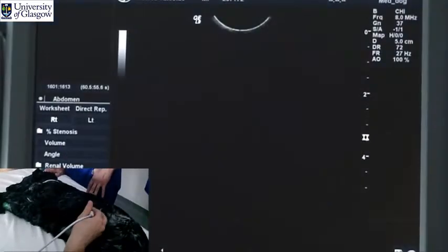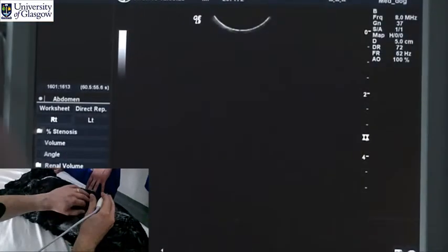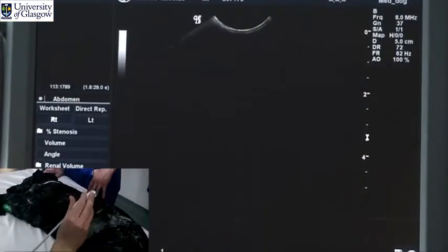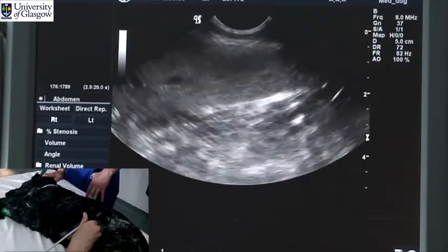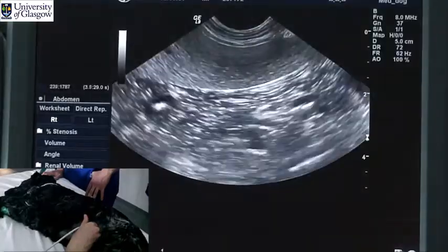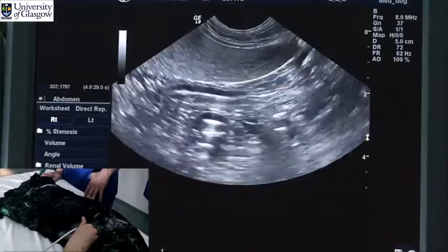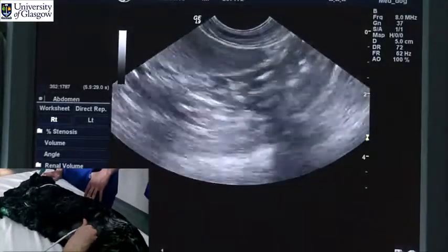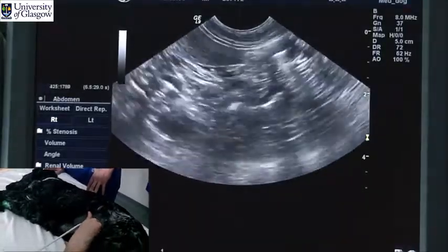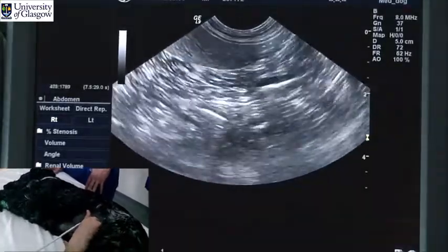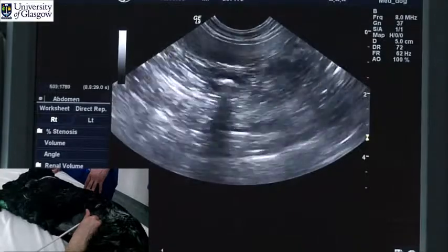To look at small intestinal loops, it is normally easier to have the probe in a dorsal plane, placed on the mid-abdominal wall, where we can identify loops of small intestine running through the middle of the abdomen.